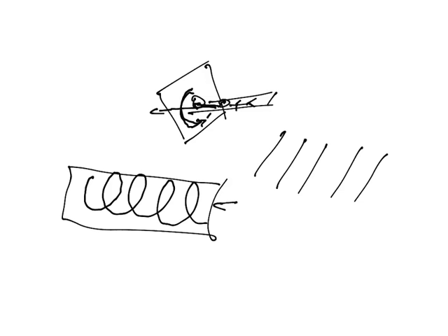This X-ray generator is sending out a fan beam of X-rays, and on the other side a bunch of detectors are sitting there just detecting how many X-rays are coming in. And as it's rotating around you, you're sent through the hole in the middle of the machine, and it creates all these slices of imaging, one continuous spiral slice, in fact. That data is sent to the computer, it's processed, and spits out the 3-dimensional images.